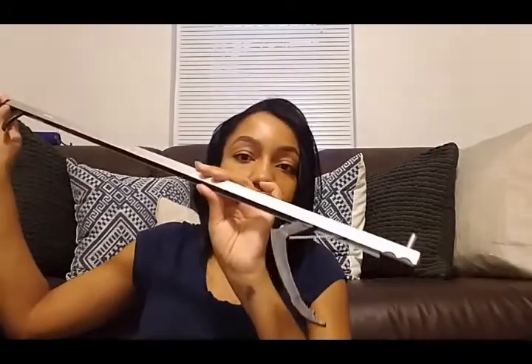So this is a reacher, or a grabber, they call it. Basically, when I squeeze this handle, this happens.